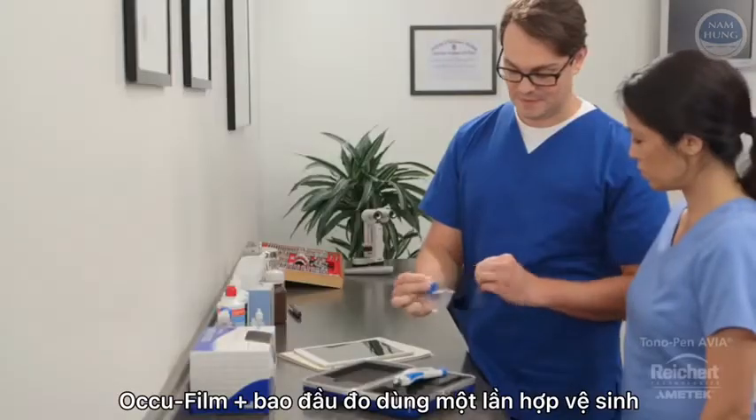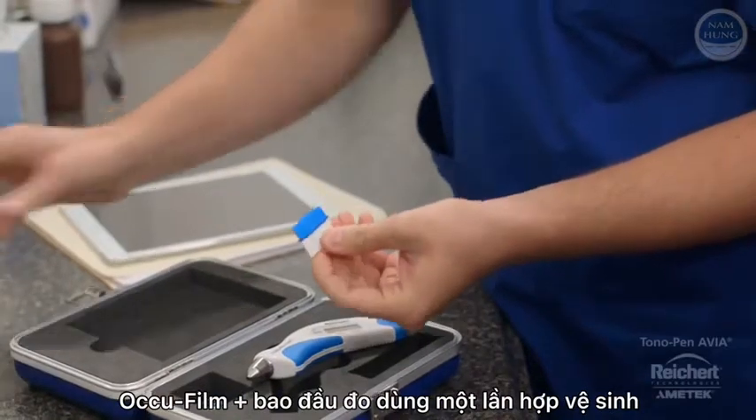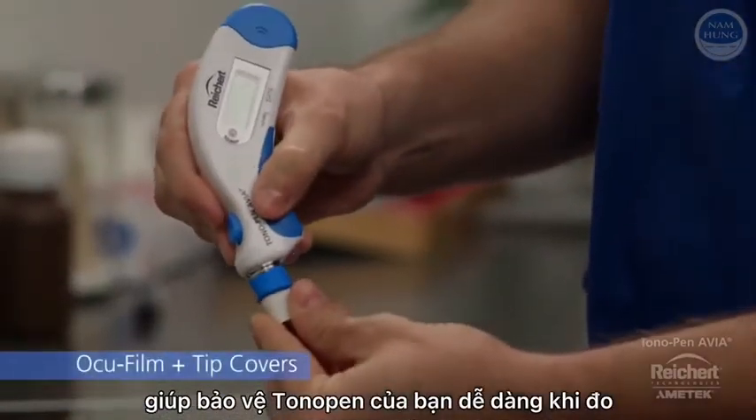Disposable and affordable single-use sanitized Rikertt OcuFilm Plus tip covers protect your Tonopan and are easy to apply.